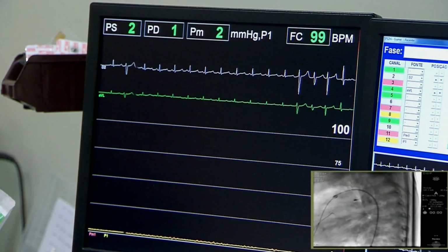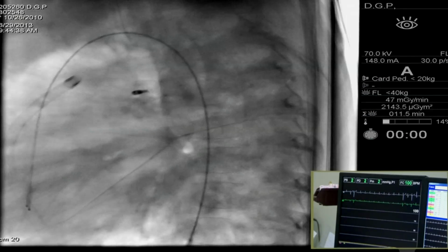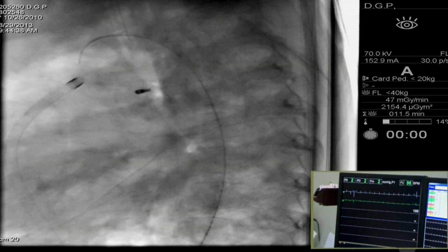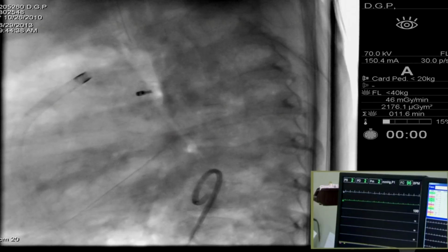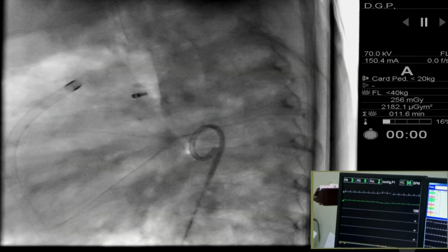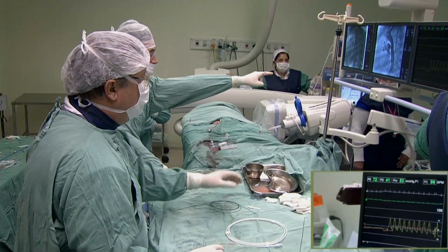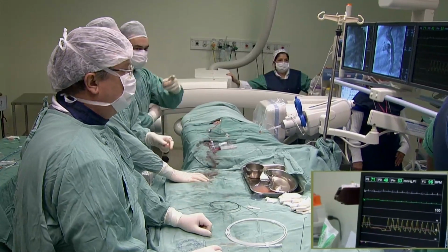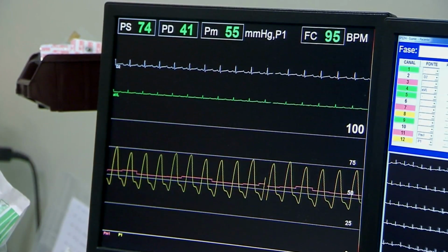That's a different sort of pullback, but never mind. Okay, it's a sort of pullback gradient. Same pressure, guys. Big screen, same pressure. We had 70, so there's a bit of amplification.